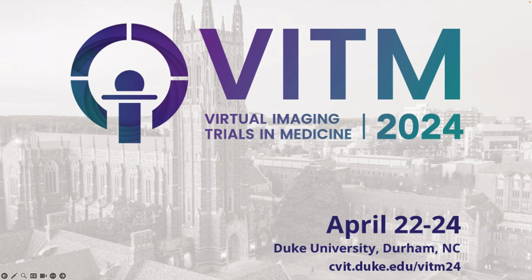Yeah, that's a great point. We have recently looked into osteoporosis and multiple myeloma as two major bone diseases. We haven't done it with MRI, we have done it with CT, and the idea is with the recent advancement of photon counting, that you have spectral capability and improved spatial resolution, how much of that would benefit more accurate quantification of diseases via CT.